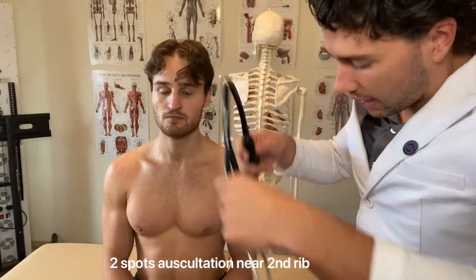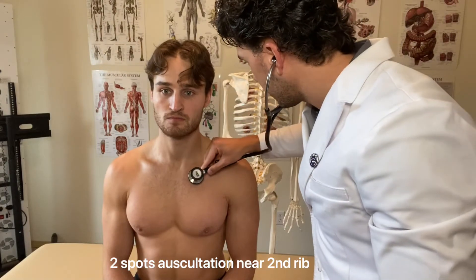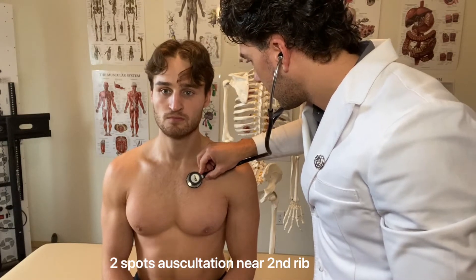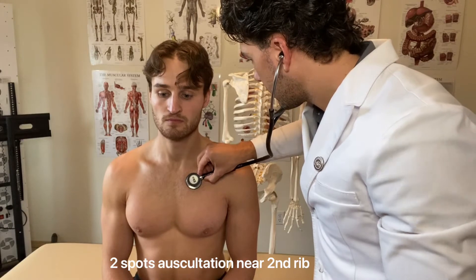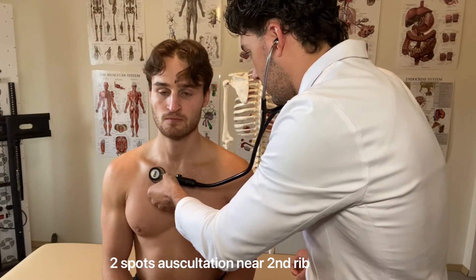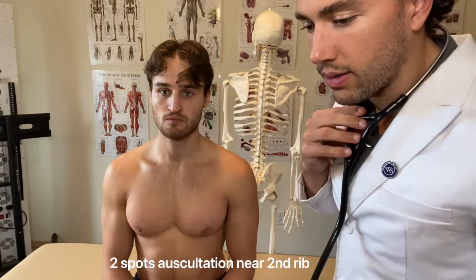So then I'm able to move on to the auscultation portion. I'm going to first show you the two anterior sides, and then we're going to go to the back side. Whenever this touches your skin, just take a breath in. I'm by the second rib, then the third rib.